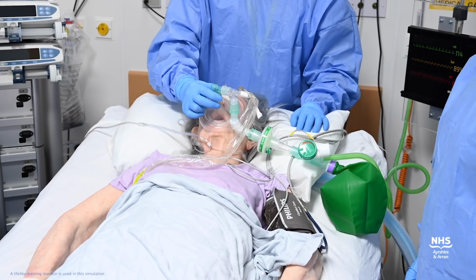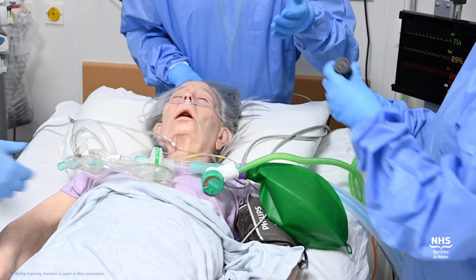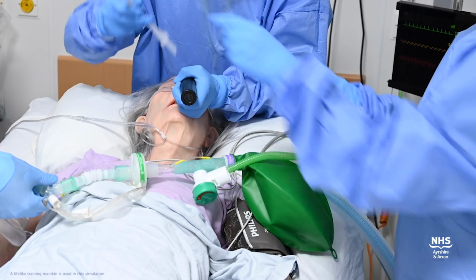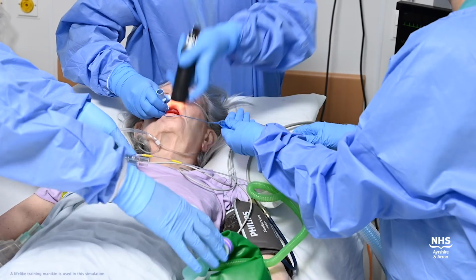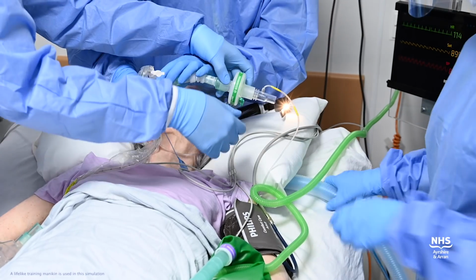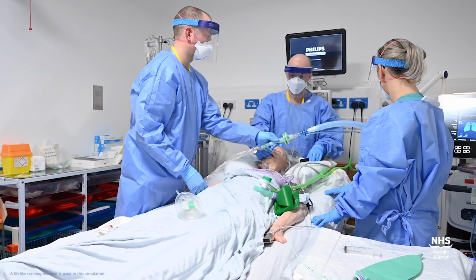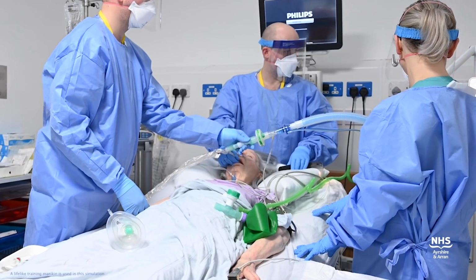After 45 seconds has elapsed, perform laryngoscopy using a disposable laryngoscope or videoscope if available. Once the ET tube is successfully inserted, ensure the pilot balloon is inflated prior to providing any positive pressure ventilation. The ET tube should be connected to the ventilator circuit as shown. Positive pressure ventilation using the ICU ventilator can now be commenced.